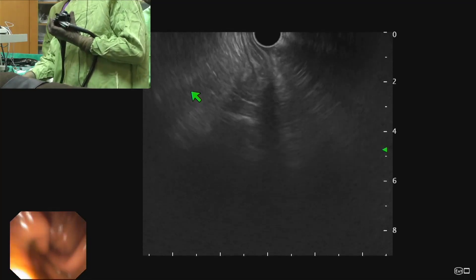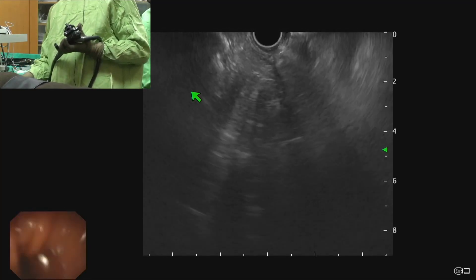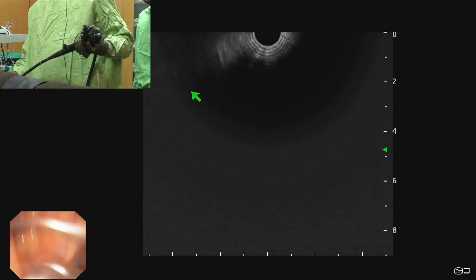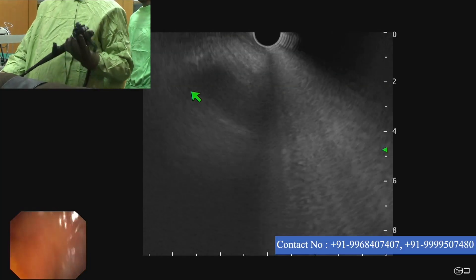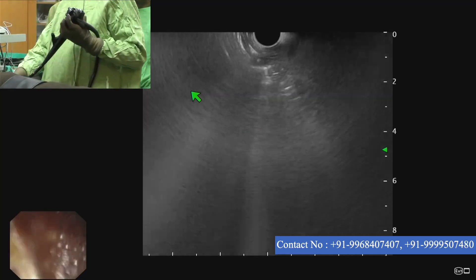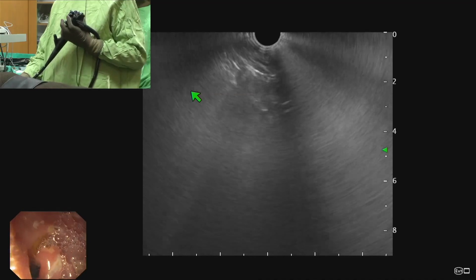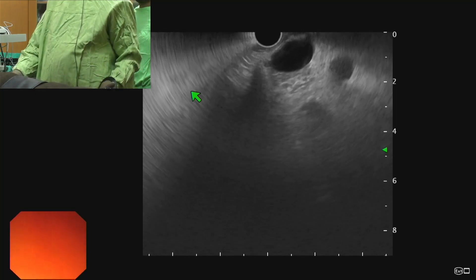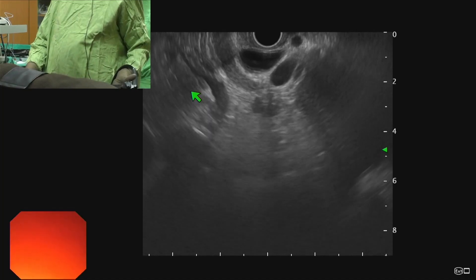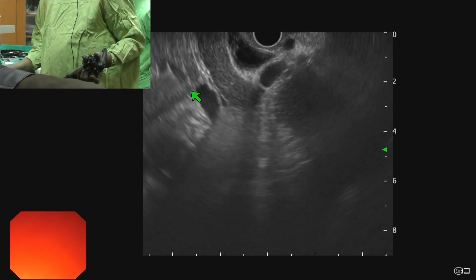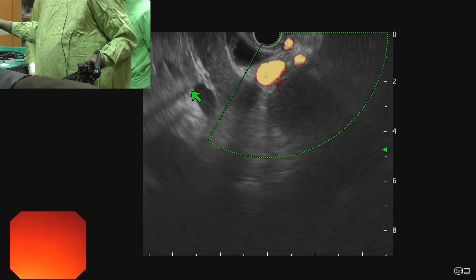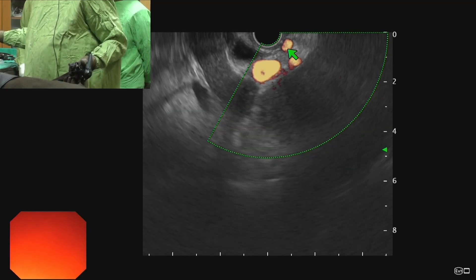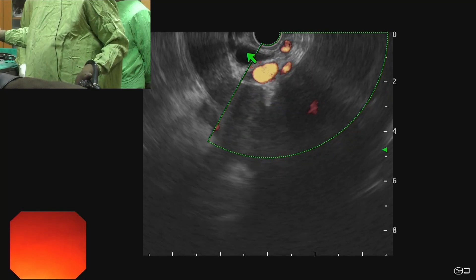The second station is the first part of duodenum. We go inside into the first part of duodenum and go to the angle between the first and second part. We rotate the scope anticlockwise. Once we rotate anticlockwise, we can see two structures. This is the portal vein. That's the hepatic artery, and that could be the bile duct.